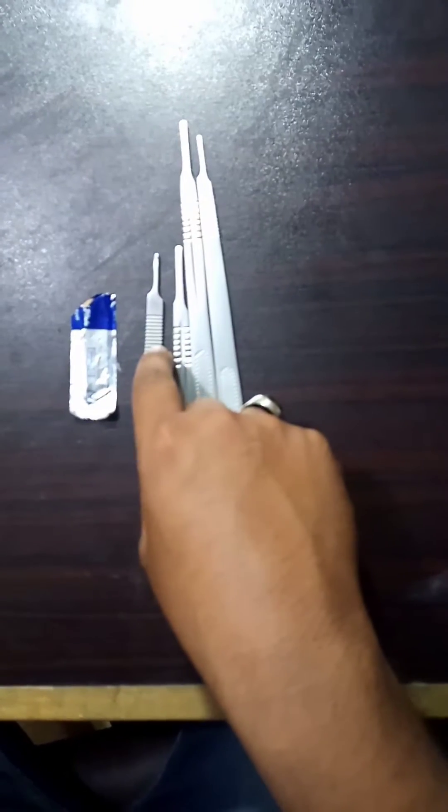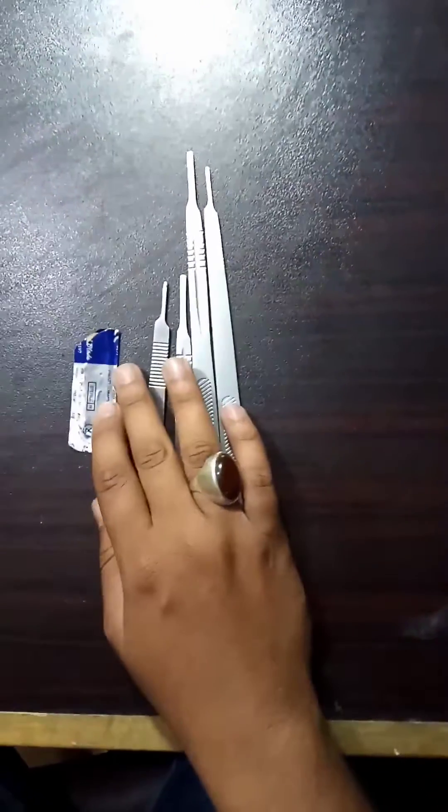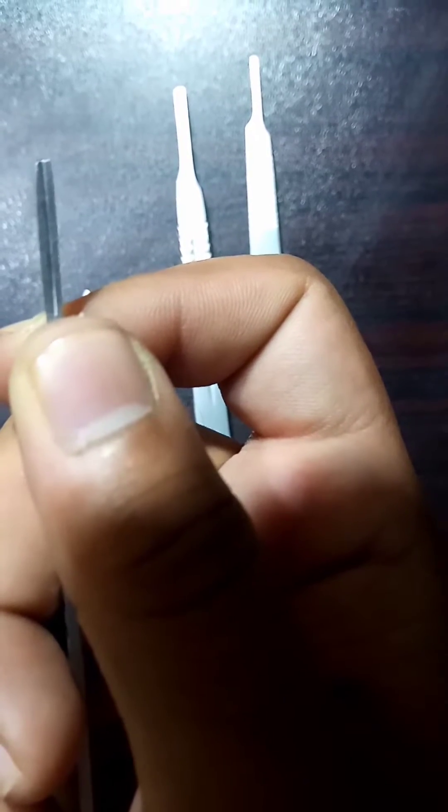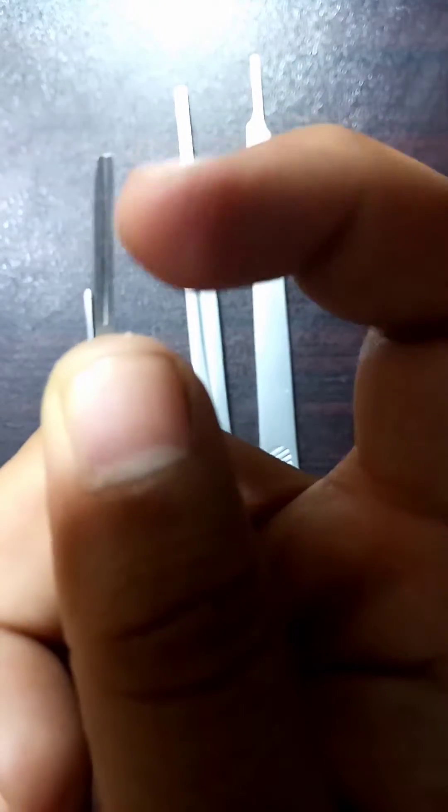The lower part of the scalpel handle is reused. There is a groove around the tip of the scalpel handle in which the blades are set.